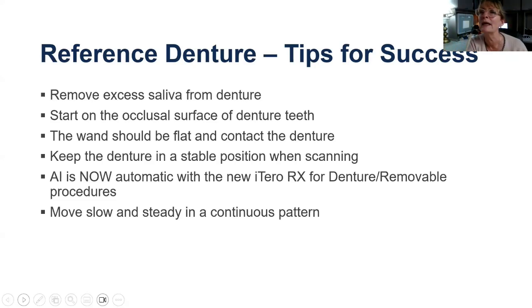has like an indelible ink on it. So you moisten the tip of the stick, and then you can use it intraorally. Typically, what I will do on the intraoral cavity is start at the rugae and make a little Christmas tree sort of pattern, going back and forth, or a few X's, especially where the vibrating line is.